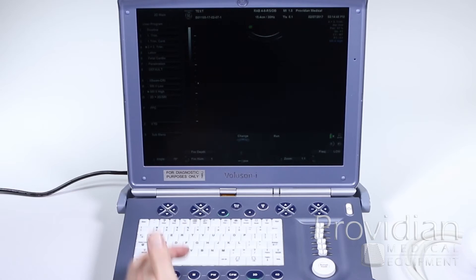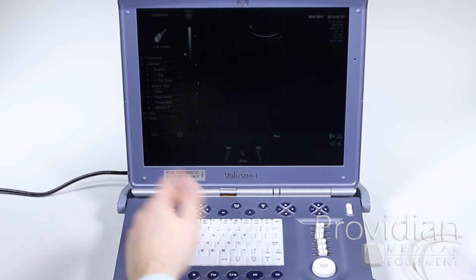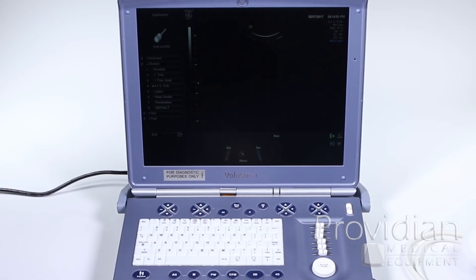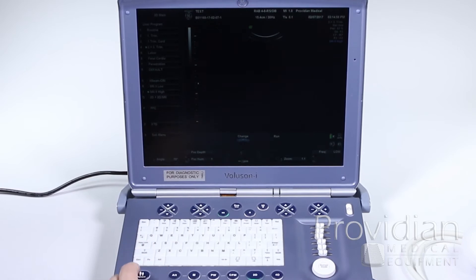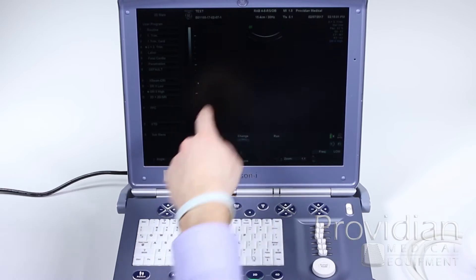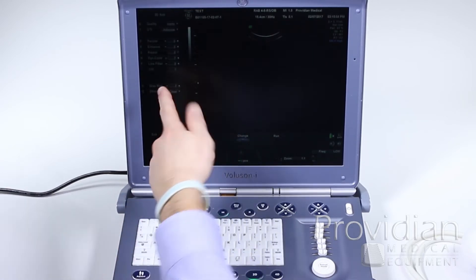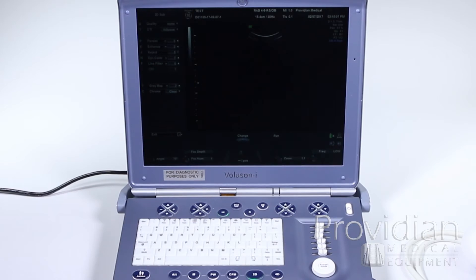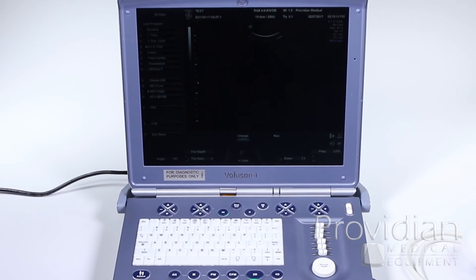The next thing I would do is choose my application by clicking on this application button here. It's going to allow me to select the preset that I'd like. As you notice, it is all up here too, but that will disappear. Along the left-hand side here you have a lot of different features, including this S button. If I push S, I get to a submenu where there are further image optimization tools. For now, I'm going to choose that application, choose second and third trimester, and begin imaging.